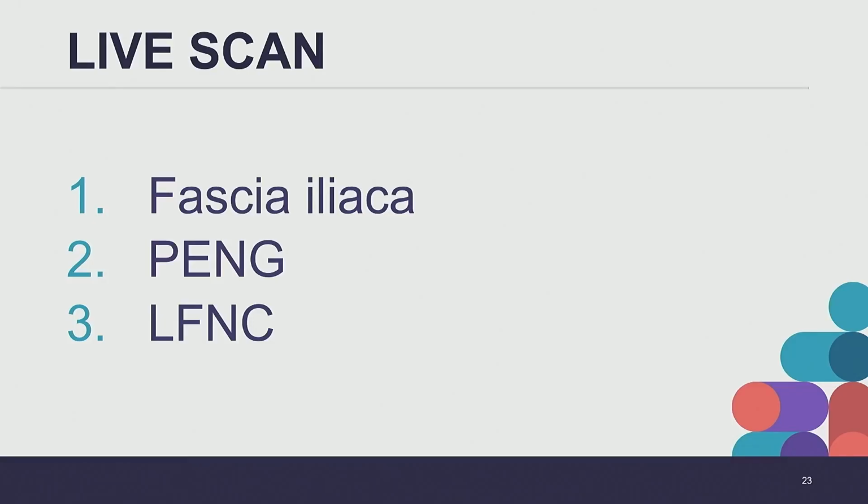So we go in, remember each one of those marks on your echogenic needle or peripheral nerve block needles is only 1 centimeter. So not even getting into that entire mark will achieve a blockade of that lateral femorocutaneous nerve there. Let me just switch the probes.